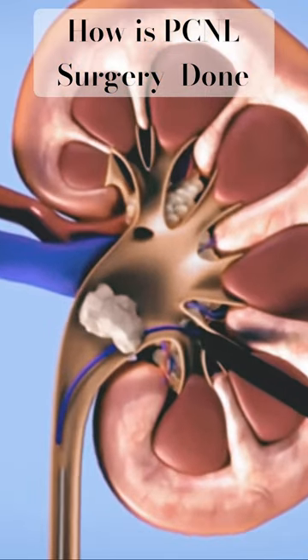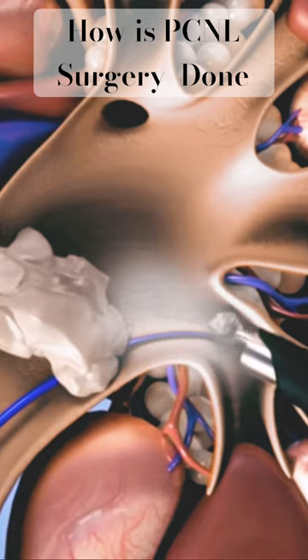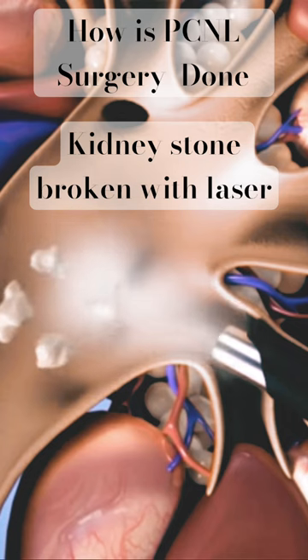The guide wire allows the nephroscope to safely access the kidney. Some stones can be removed directly using a grasper. Larger stones need to be fragmented first using a device like a laser before extraction.